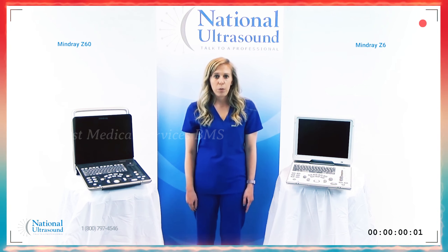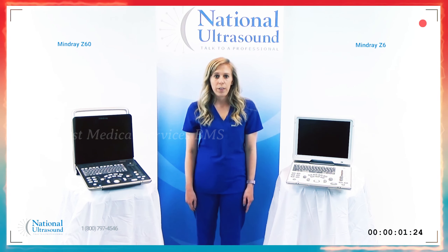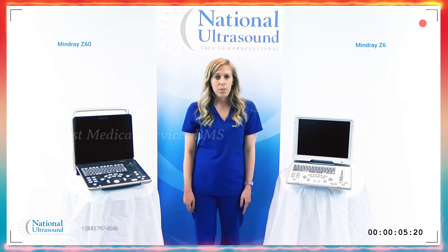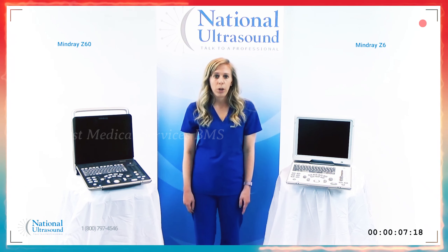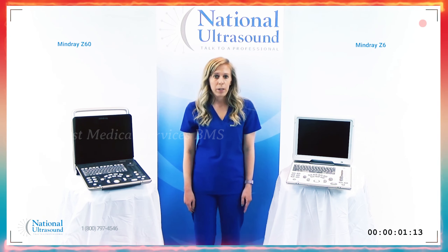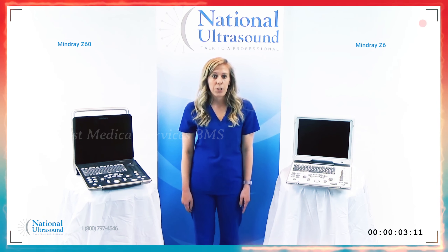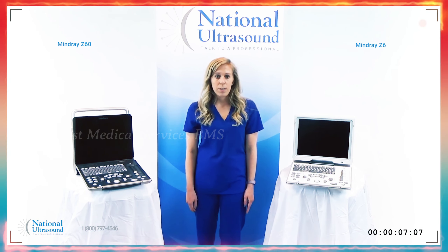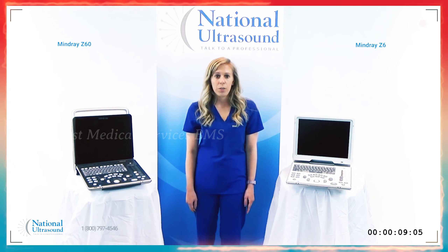iWorks is now available as a standard feature on the Z60 system. iWorks includes standard work protocols built into the machine that can be turned on while scanning, to make scanning more efficient by showing each step that should be included in a standard scan. The Z60 includes all the original Z6 features.